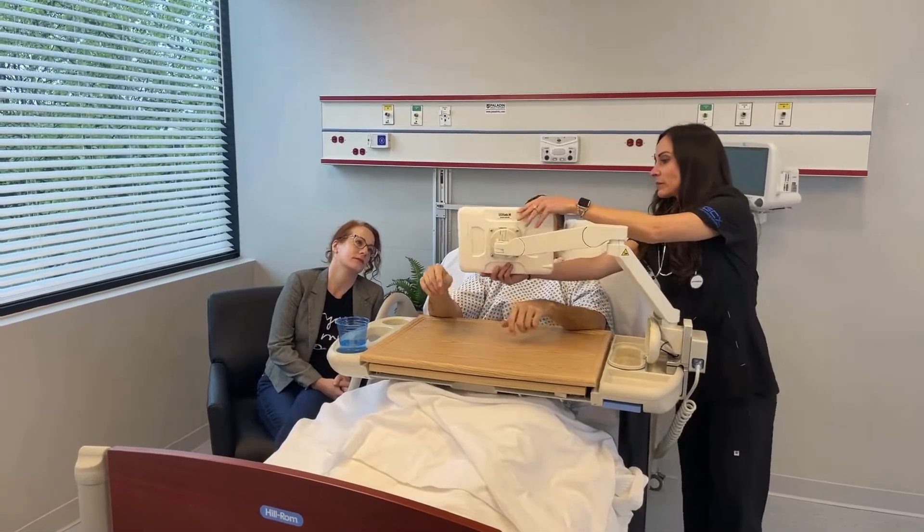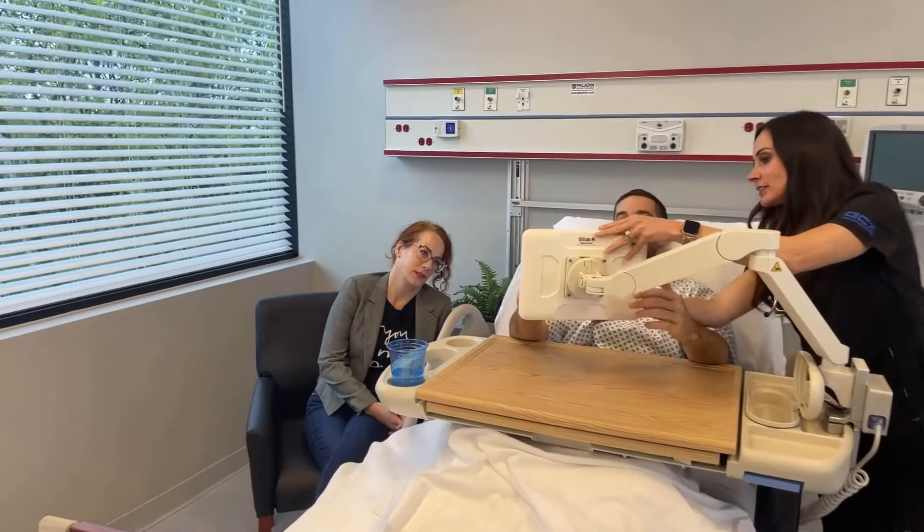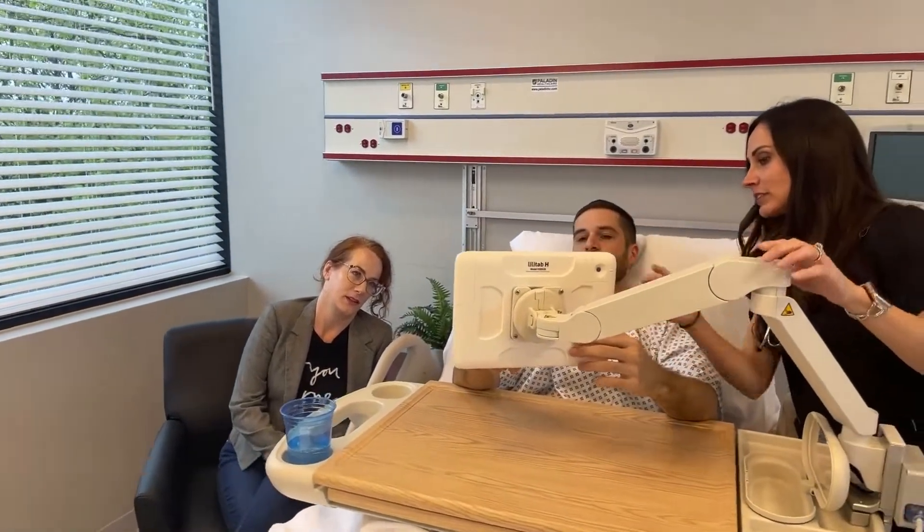The variable height arm is available with or without an extension for optimal reach, allowing you to accommodate multiple users.